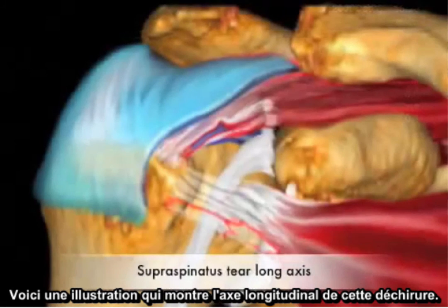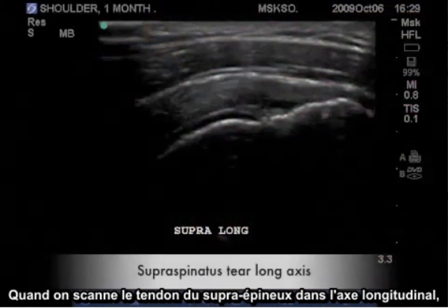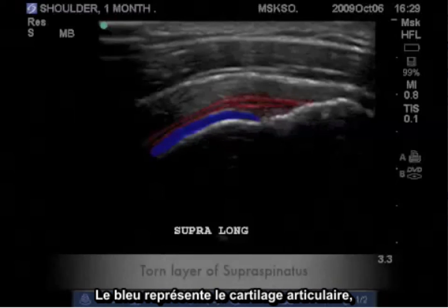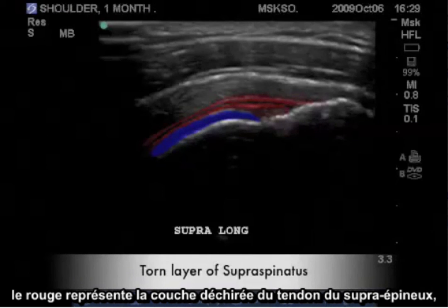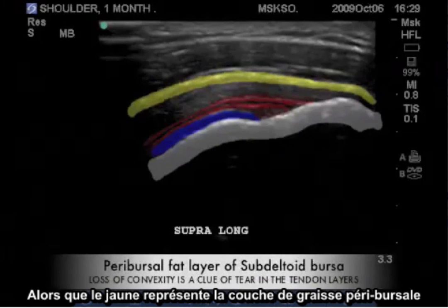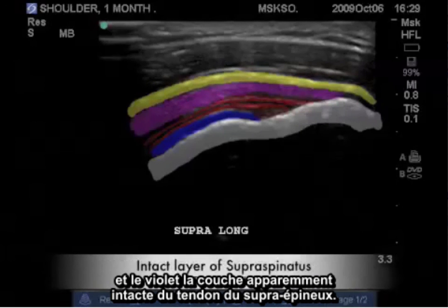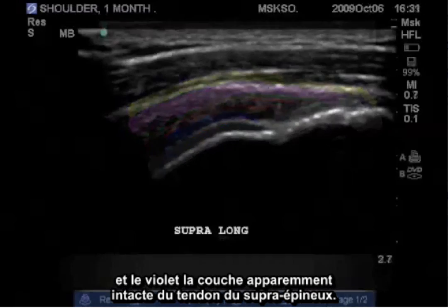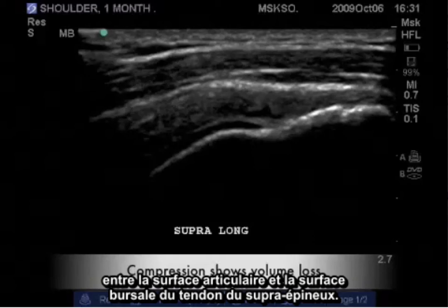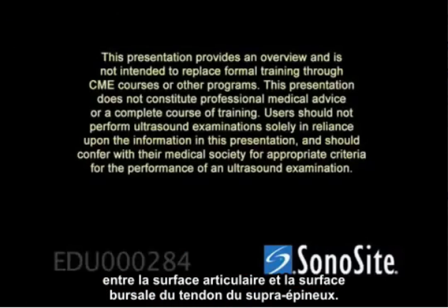Here is an illustration depicting the long axis of this tear. When imaging the supraspinatus tendon in long axis, rely on your bony landmarks. The blue represents the articular cartilage, the red represents the torn layer of the supraspinatus tendon, the white is the cortex of the humeral head and greater tuberosity, yellow represents the periversal fat layer, and the purple represents the seemingly intact layer of the supraspinatus tendon. It is the compression of the probe that reveals a full thickness communication from the articular surface to the bursal surface of the supraspinatus tendon.